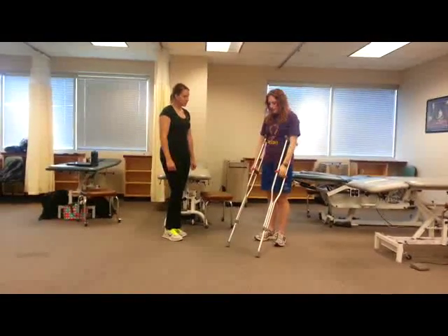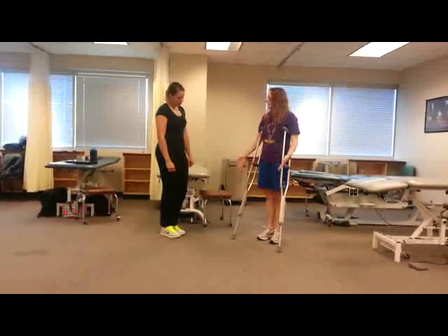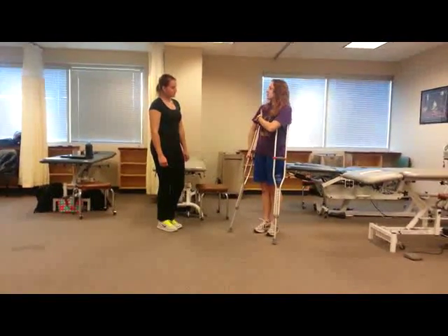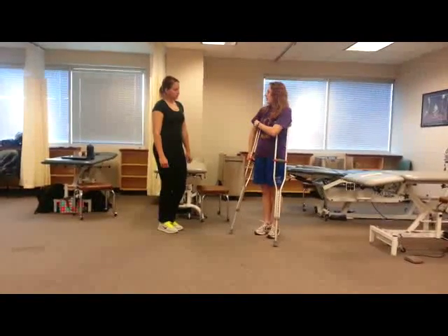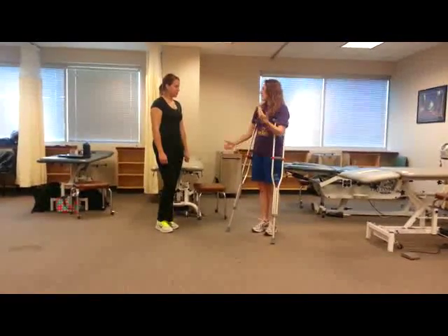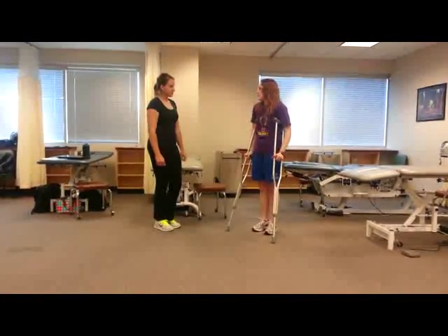You want to have them at about six inches apart from you at about a 45-degree angle. That's a good, nice stable base of support for your patient. Then you want to make sure that there's about two to three fingers of space between your armpit and where the crutch is. That ensures that we're not up in the armpit damaging nerves. A lot of patients will tend to think you're supposed to be all oiled in there, but it's more of a squeeze.